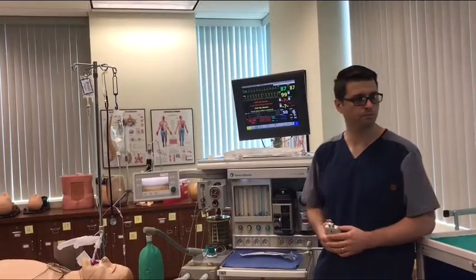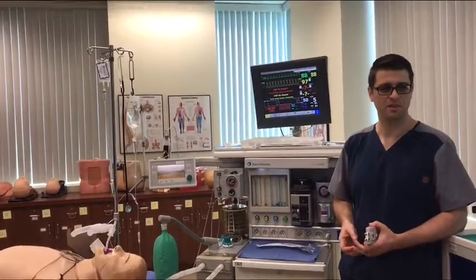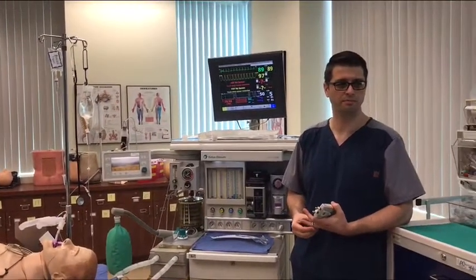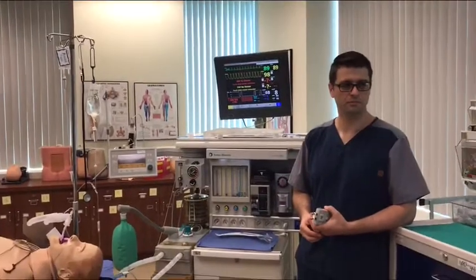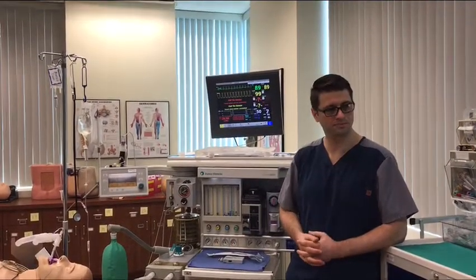You said breathing. Never mind. Spontaneously breathing. I know what you meant. Okay, I haven't heard this yet. End-tidal sevoflurane. What's my end-tidal? Do we have any gas?